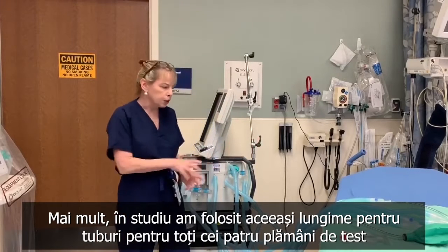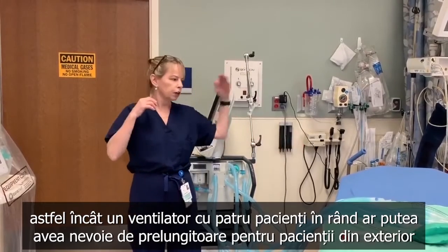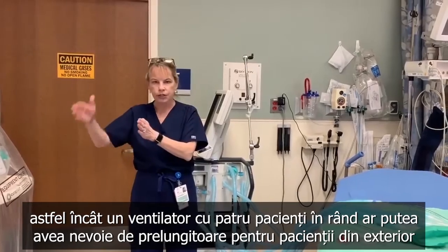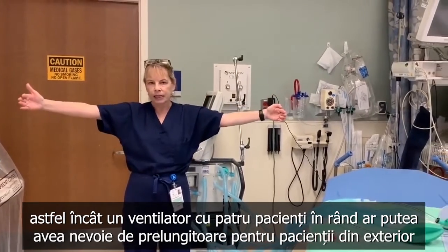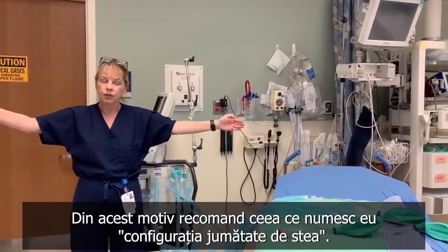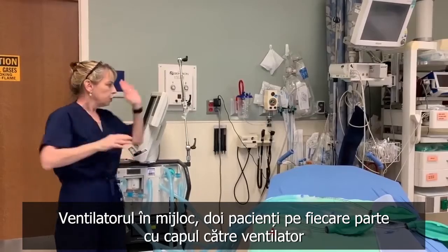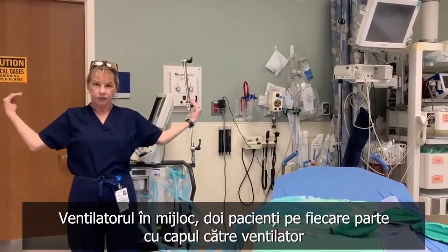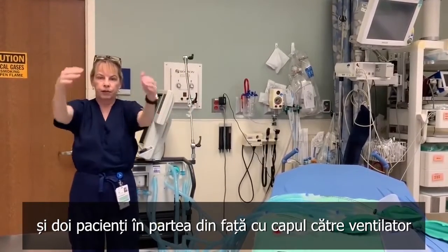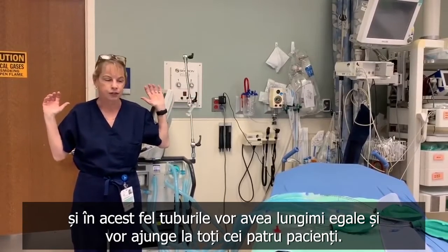Additionally, in the study, we use the same length tubing for all 4 test lungs. So if you had one ventilator with 4 patients in a row such as that, the patients on the outside might need extenders to have the tubes reach the ventilator. For that reason, I would suggest what I call a half-star configuration. So the ventilator in the middle, 2 patients on either side with the heads facing the ventilator, and 2 patients in front with the heads facing the ventilator. And that way, the same length tubing would be able to reach all 4 patients.